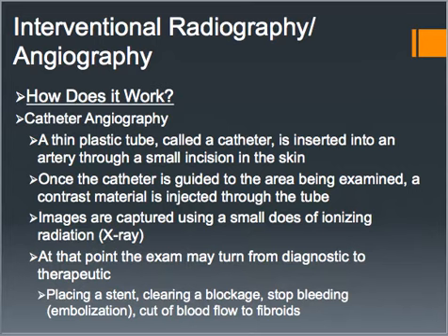So up until this point, the procedure is completely diagnostic. They're looking at things, checking to see if there's any diagnostic reason to do a procedure. But if the doctor finds an issue, that can then turn into a therapeutic procedure at that point. So everything can be done under one procedure without the patient having to have a diagnostic exam and then come back later for the surgery or a therapeutic procedure.